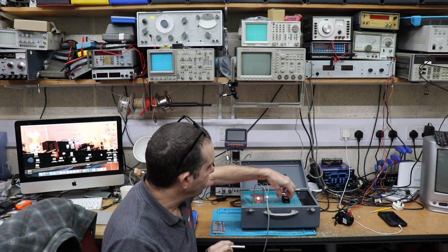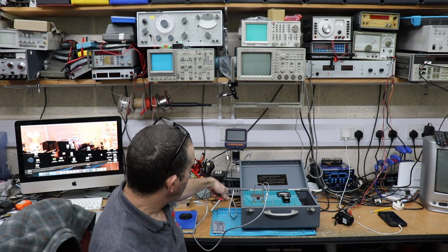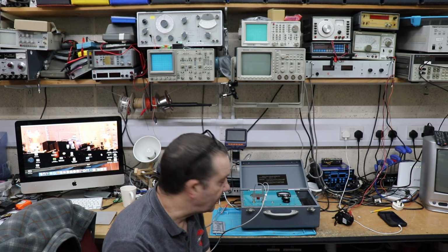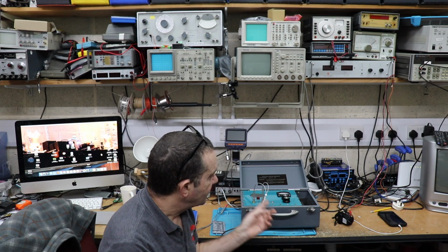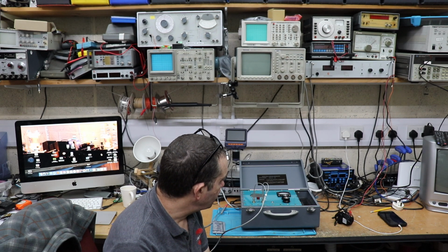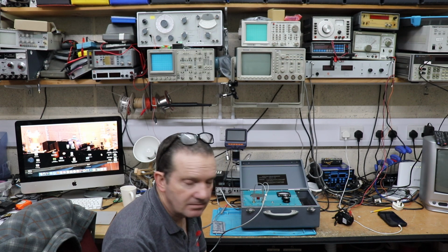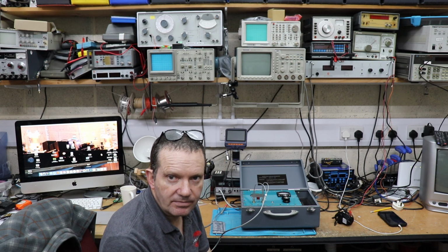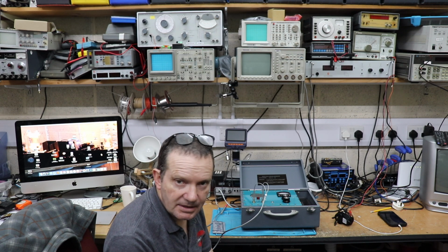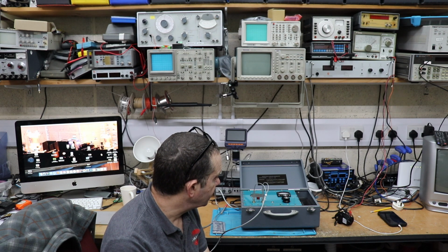a Doppler machine, which is a tool that we use quite often in the hospitals. As a vascular surgeon, which is my day job, we use machines very similar to this, but quite a bit smaller. They're quite useful pieces of kit for assessing blood flow, particularly in the legs, which is often the area where people need various things doing to improve the circulation.